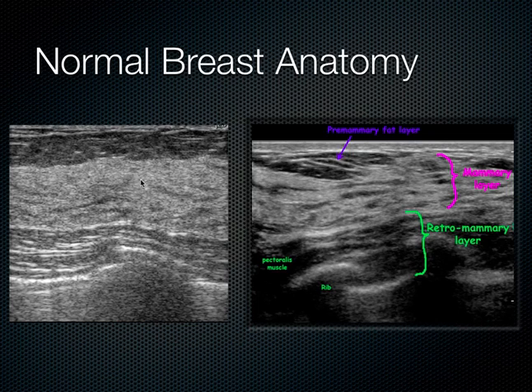And then, like all glandular tissue that we've seen on ultrasound so far, the thyroid, the testicles, things like that, it has this sort of appearance, relatively isoechoic here, with the different lobules of breast tissue here. So that's called the glandular layer. And then behind that is what we call the retromammary layer. And this is basically skeletal muscle, pectoralis muscle, we can see here.